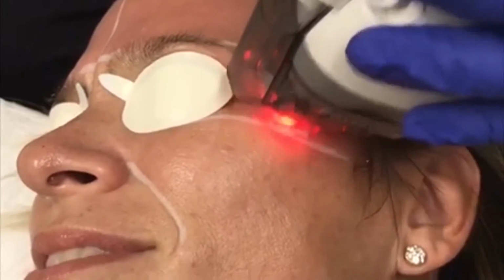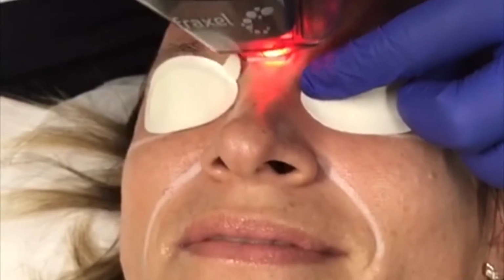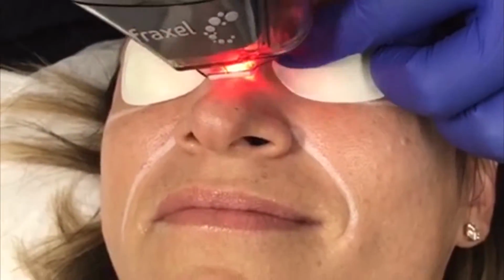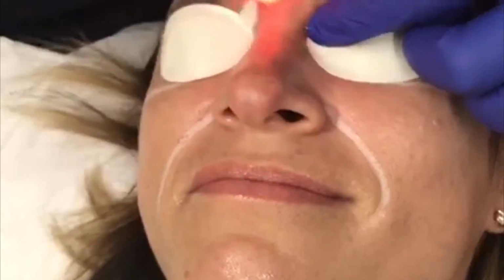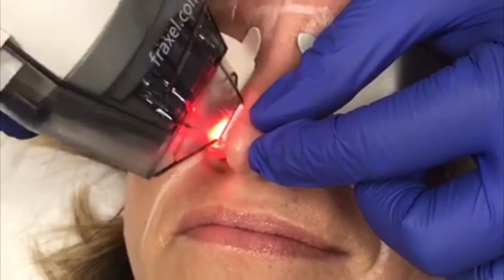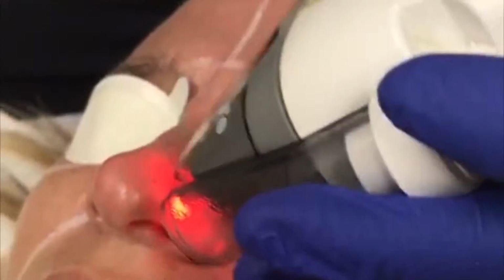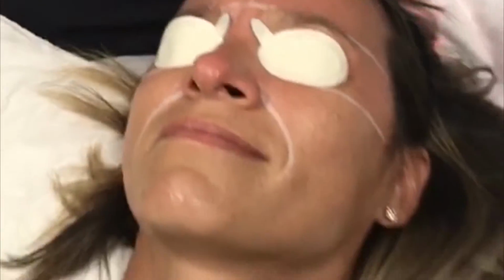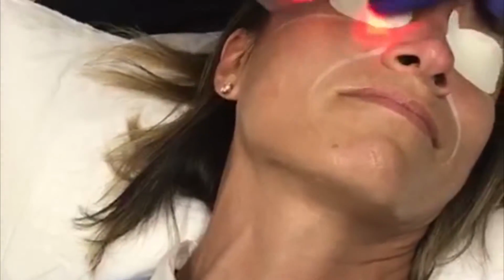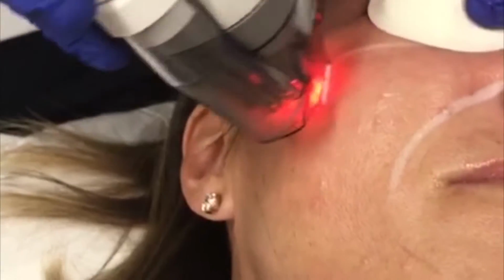Pain control is very important when performing this type of procedure. All patients in my practice have topical anesthesia applied for about 20 to 30 minutes. This is specifically important to be rubbed into the area of the hairline and around the earlobe and ear area because those areas tend to be the most painful. We also use cooling anesthesia during the procedure. So in this video you could see that the cold air is directly attached to the handpiece. Sometimes I'll have one of my assistants actually hold a hose with cold air coming out and sort of cool the patient as we're performing this type of procedure.